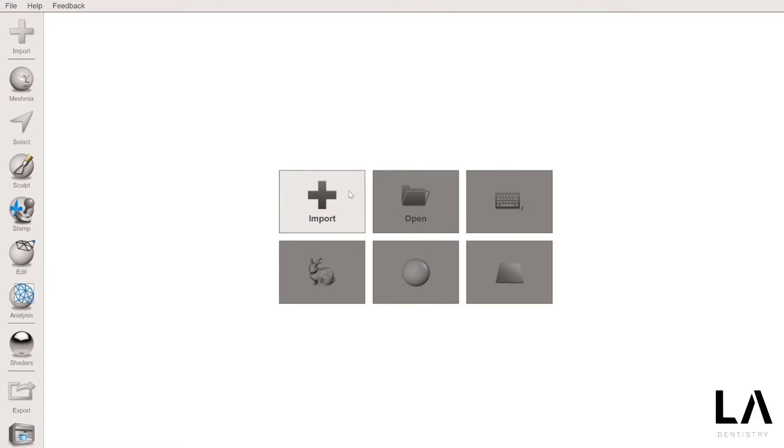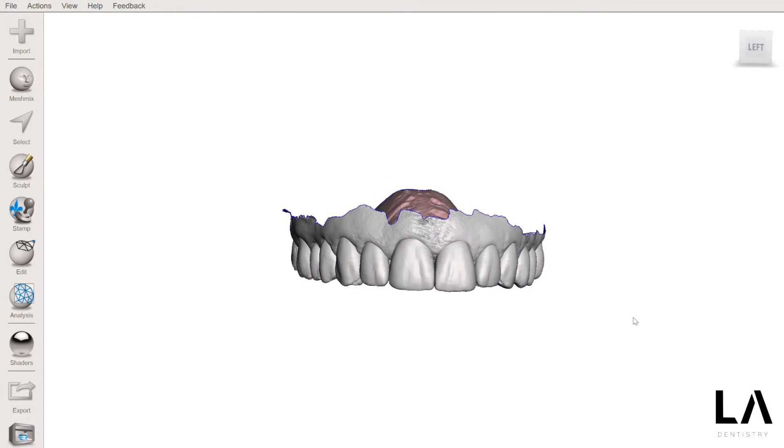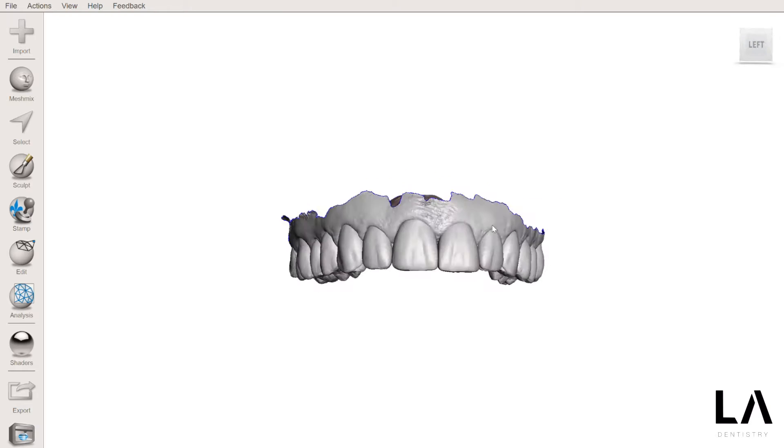This is Dr. Luis Ange and today I'm going to show you how to prepare a model for 3D printing. Now that we have the model here, I'm going to prepare this for 3D printing.